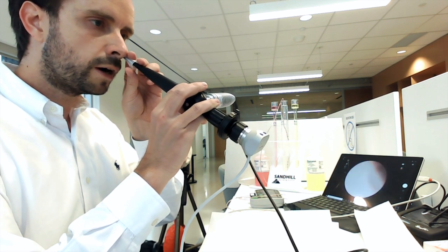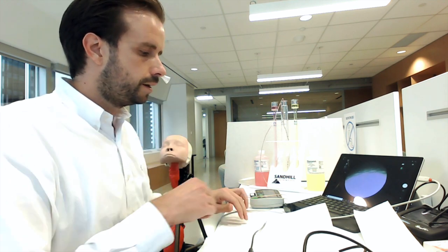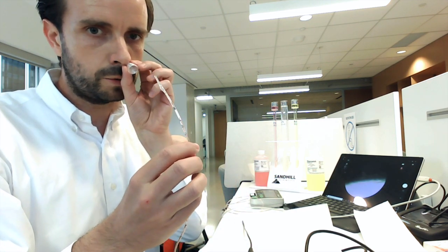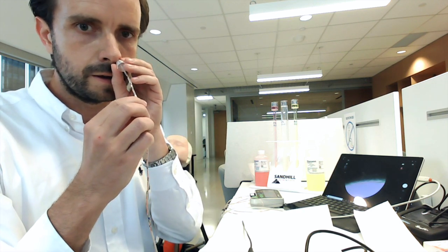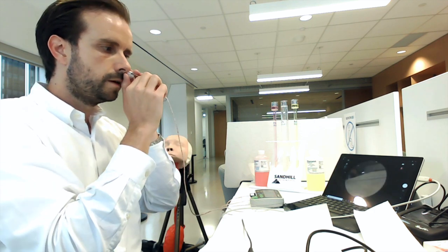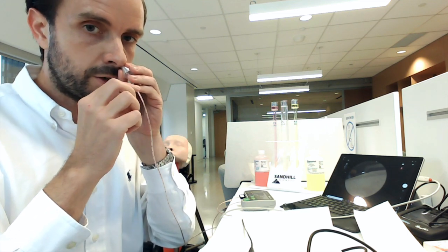Next step is pulling out the endoscope. Now we take the reflux probe and feed it through the introducer. Now at 30 centimeters, that should be good enough for our positioning.